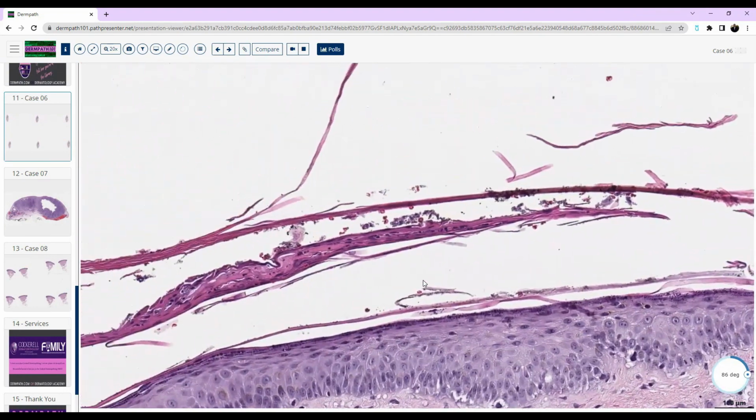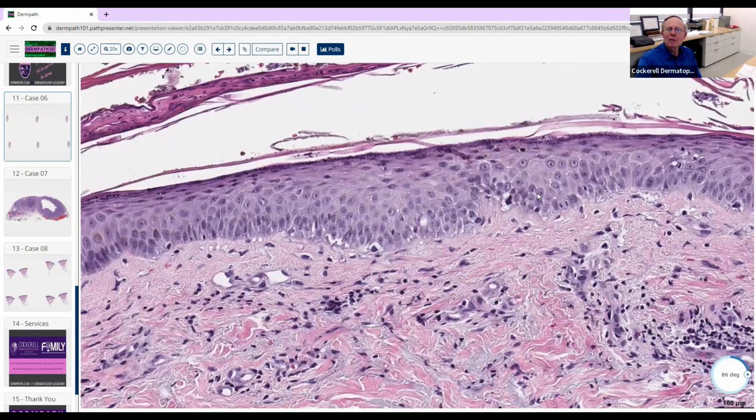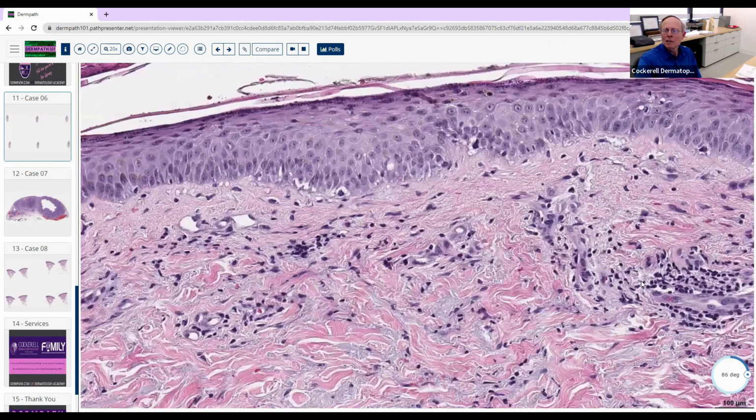We could also think about IgA pemphigus, but we'd expect to see some papillary dermal edema with that. There could be some eos in that one. Pustular tinea, with that, if you notice the eosinophils here, and you said, well, gosh, tinea is in there, bullous impetigo. Do you get eosinophils in those conditions?